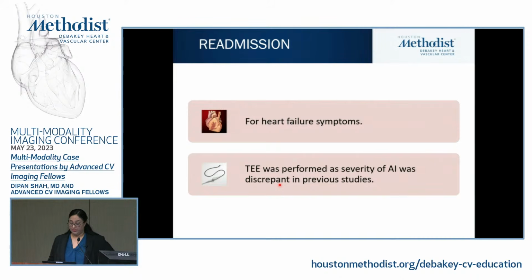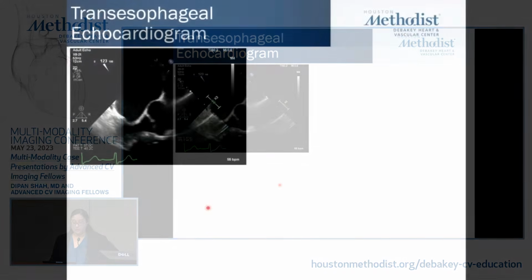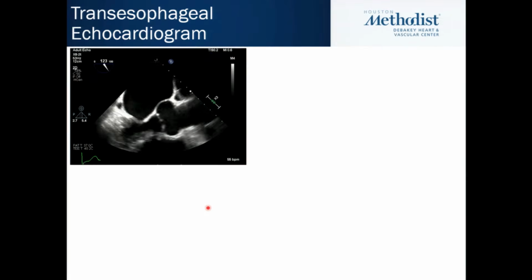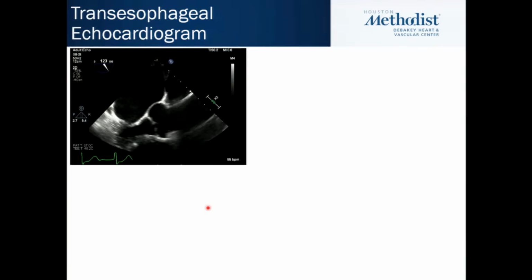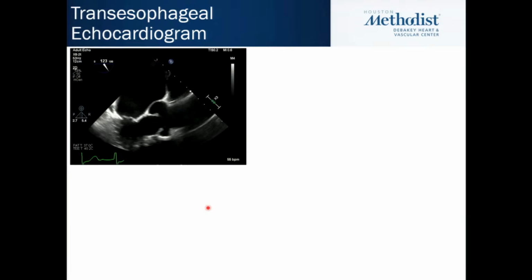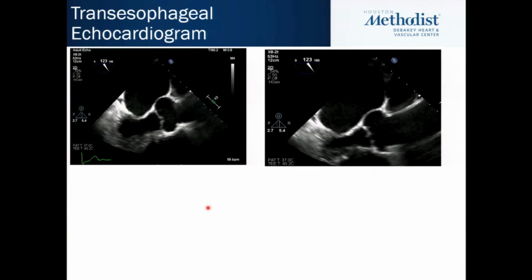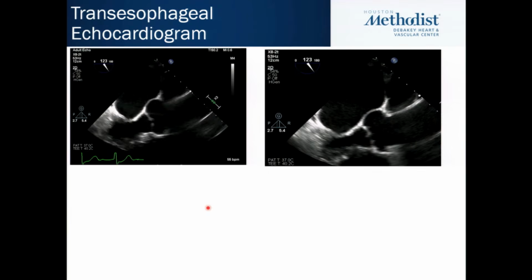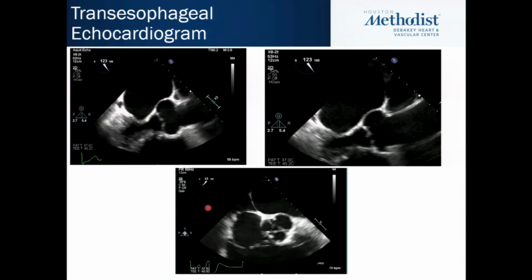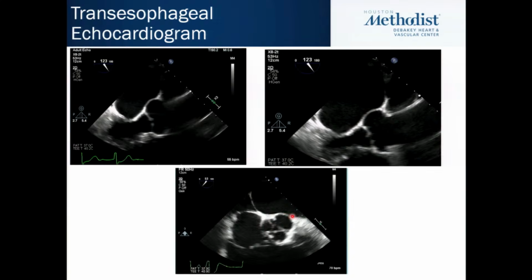Thank you, Dikshita, for masterfully showing us the methods of valve assessment with CMR. So we go on to our first TEE view for this patient. This is the mid-esophageal long axis view, which shows us a ventriculoarterial dilatation or an annular dilatation. You see a normal leaflet motion. So this is a Carpentier 1C, and you see a coaptation defect. I've given a snapshot of the coaptation defect in the long axis view. And this is the short axis view, which also shows us the coaptation defect here.